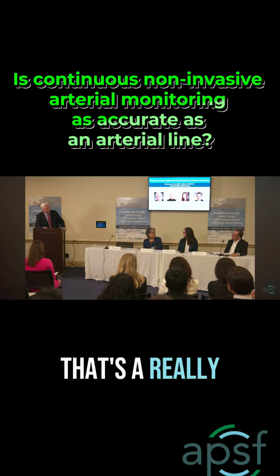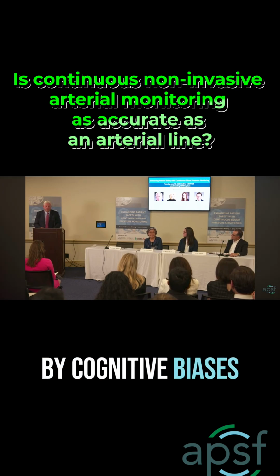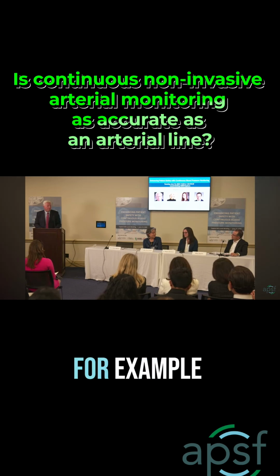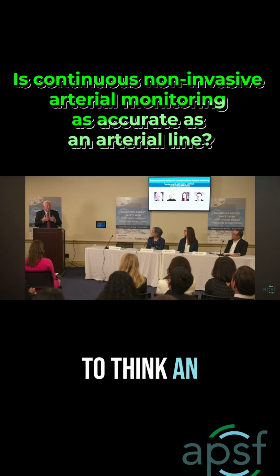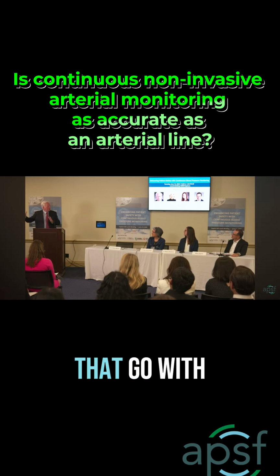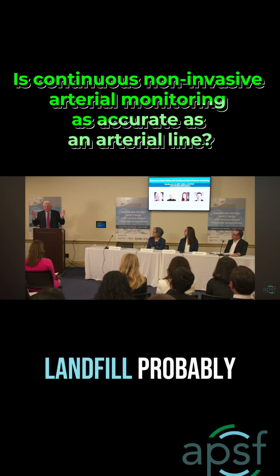Megan, I think that's a really key point that you make, because a lot of clinical decision-making is affected by cognitive biases. And you're right, nobody wants to do those painful, invasive things in young, healthy moms, for example. We, or me back in the hospital, used to think an A-line was virtually free because it's just a little plastic pipe we pop in. We forget all the other bits that go with it, which leaves a huge pile of plastic at the end of it. It's a massive pile of plastic that goes into landfill probably.